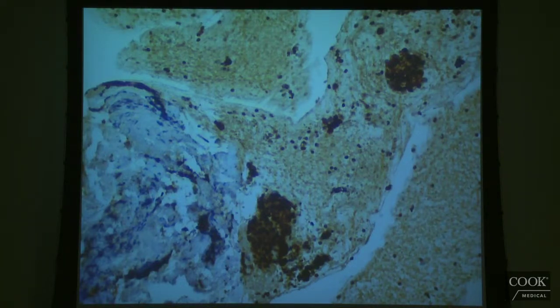So just to give you the background of this case, this is a patient that had kidney cancer, and then they had a pancreas mass. And Roger Shree biopsied this pancreas mass, and we looked at it and we're like, okay, it looks kind of funny. It's either going to be pancreas cancer or it's going to be metastatic kidney cancer. And obviously this makes a huge difference in regards to what you're going to do for the patient.